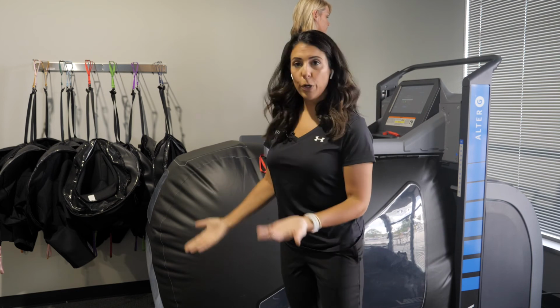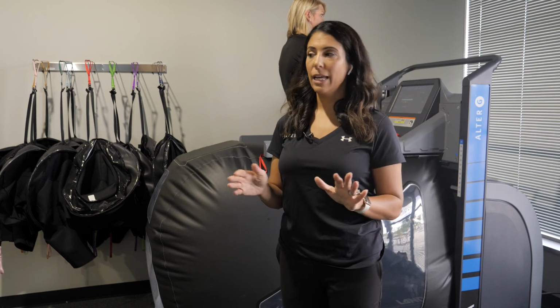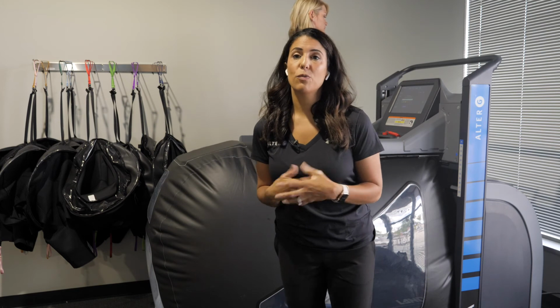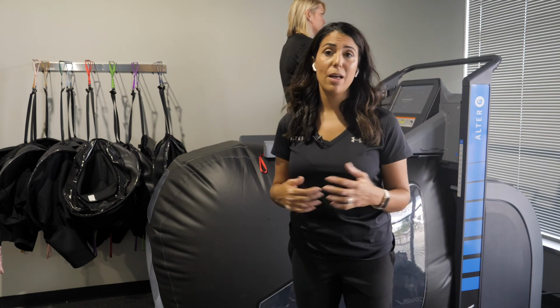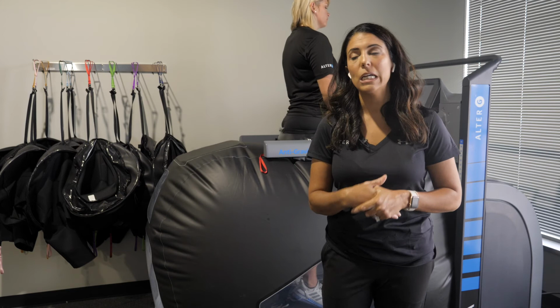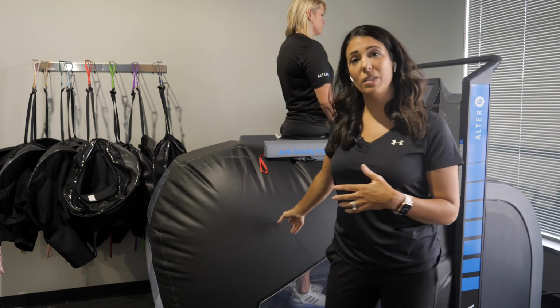If we were to put her back to 100% body weight, I can actually unzip the bag without having to recalibrate. And I can put in a balance disc, a piece of foam to really work on proprioception. So we can do single leg stance on a foam block. We can use that same block to do heel raises. Maybe you have somebody recovering from an Achilles injury or surgery. The various therapeutic exercises, strengthening exercises, agility exercises that can be done here.